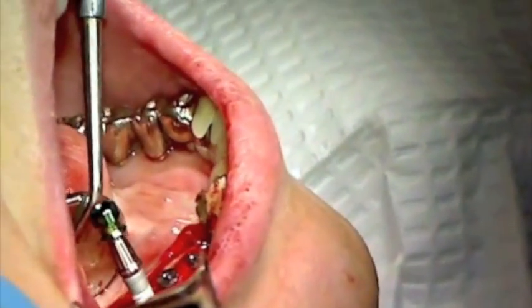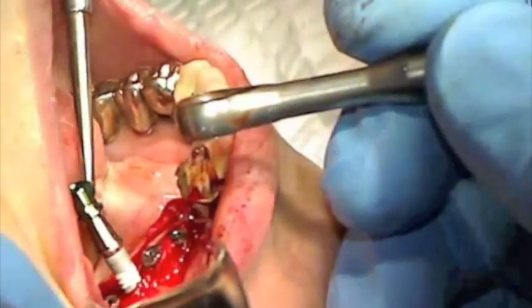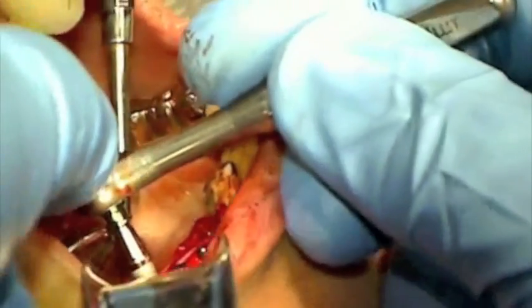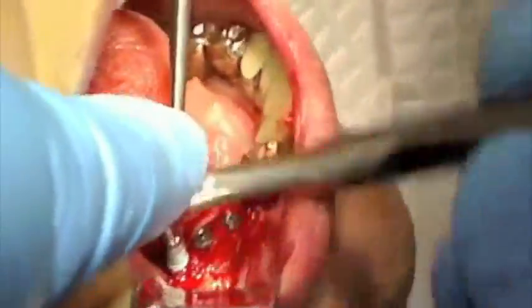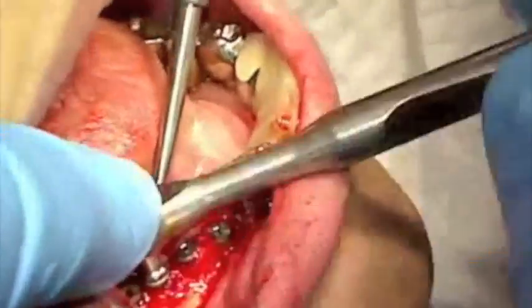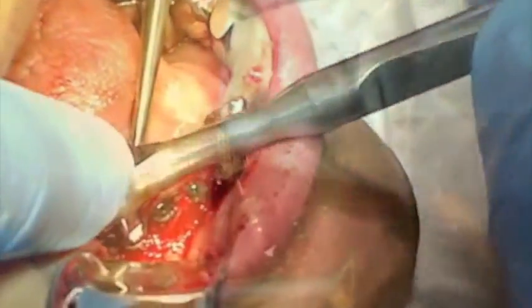The tapered design of the Legacy 3 implant allows for initial stabilization while transferring the implant to the osteotomy. Implants 2, 3, and 4 are placed 1 mm above the crest of the ridge to avoid endangering the mandibular nerve.